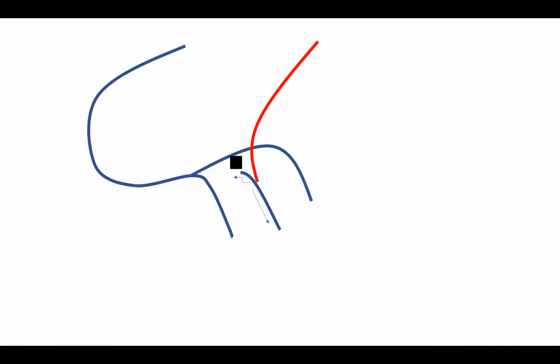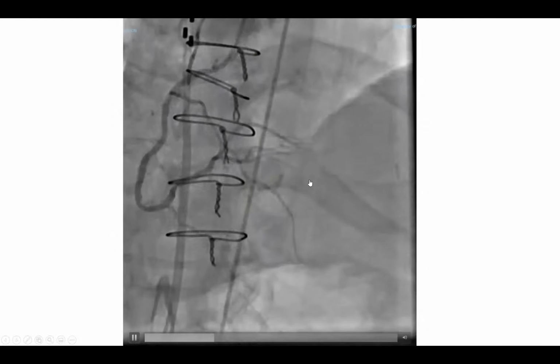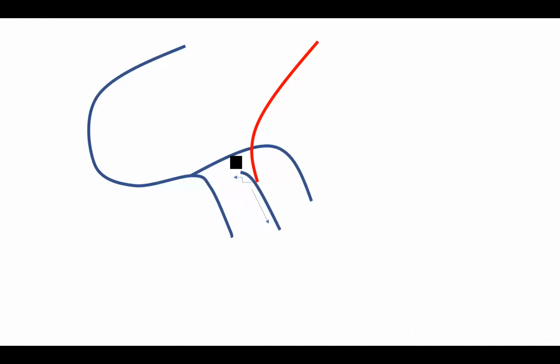Most likely, we will have to prove whether that's true. Now, if the graft turns out to be occluded, then maybe, yes, one of those was bypassed. And because the native vessels are small, the graft eventually occluded. So it's a possibility, as you see this with no competitive flows. Either the graft is occluded or most likely the graft is to an artery, a PDA that is disconnected from the native right.